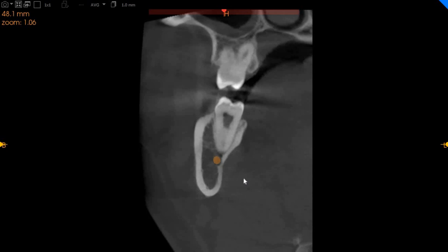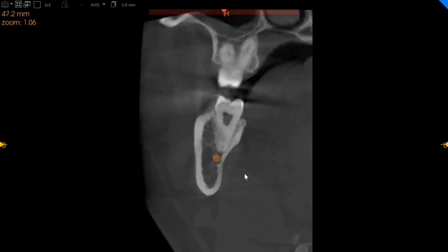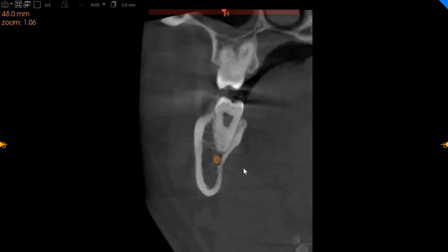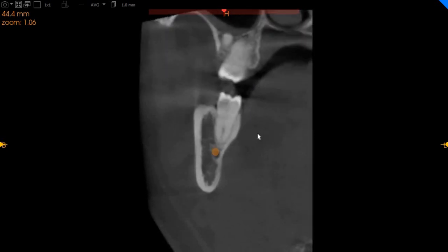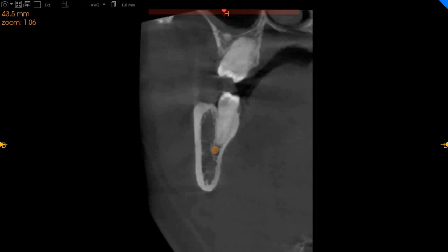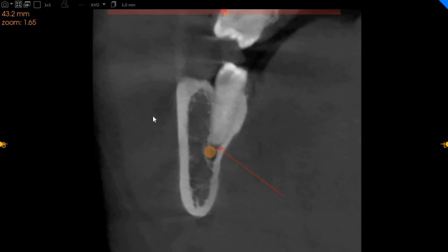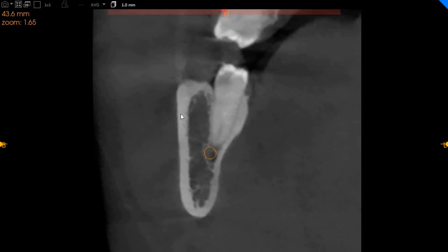As you can very clearly see, the mesial root of the lower right eight is very closely associated, but it's not compressive of the nerve, and that is a good sign. As you move towards the distal root, you can see the distal root is also in very close approximation right at this point here, but it does not compress the inferior alveolar nerve at any point. So this is definitely a good sign.